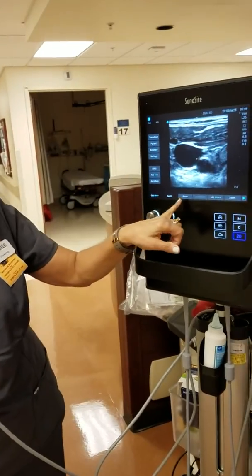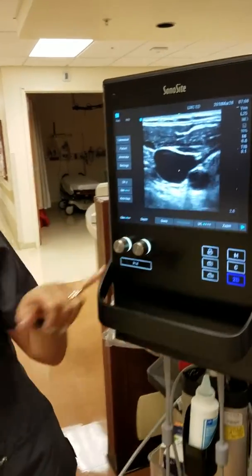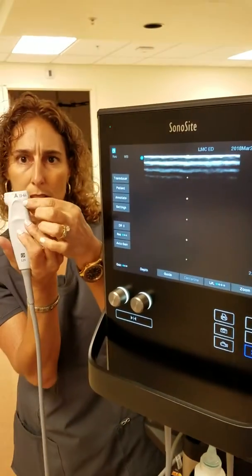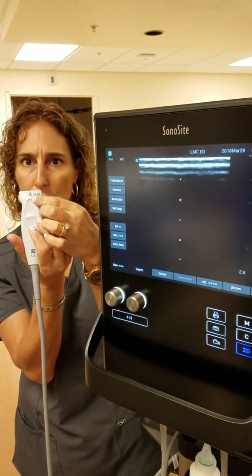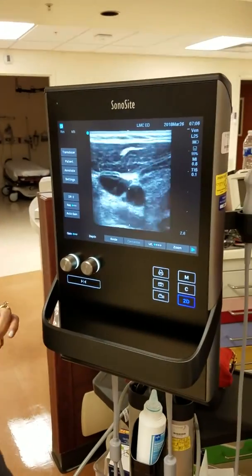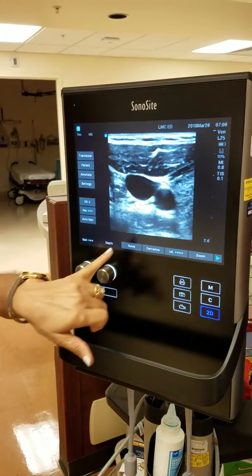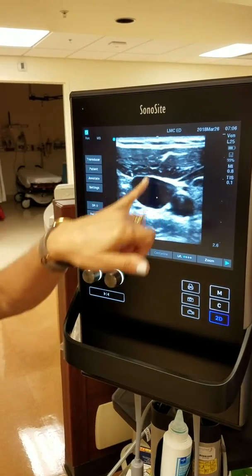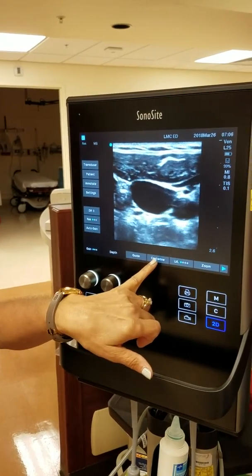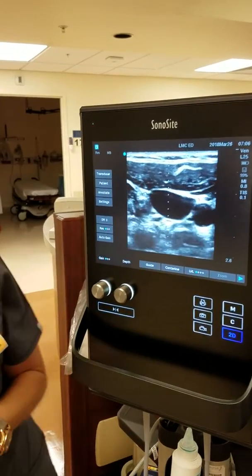This guide button — where it says 'guide' — corresponds to this yellow dotted line on screen that correlates to this arrow, giving you a center point. You can leave it on to line up your area of interest. This guide is calibrated. If you turn it off, it gives you a non-calibrated center line option — same concept, just not calibrated.